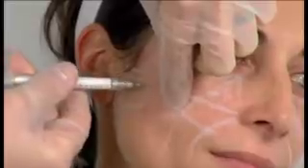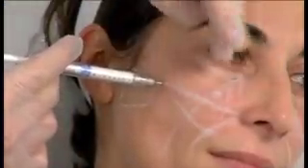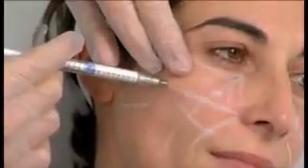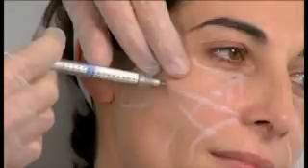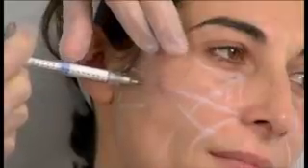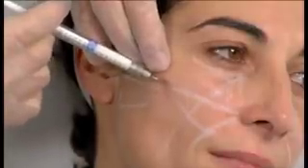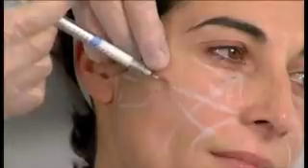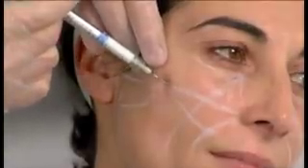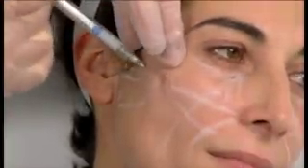Okay, so I'm down back to the periosteum, and I'm advancing my cannula over the zygoma and towards the tear trough area. As you can see, I'm very careful here because this is, of course, a very delicate area, and I'm injecting a little bit of product, and I will give her a little massage after that. I'm not going to the foramen, I'm staying away from the foramen. And you're still epiperiosteally, yes? Yes, I am. Okay. Give her a nice cheek. Staying away from the no injection zone.